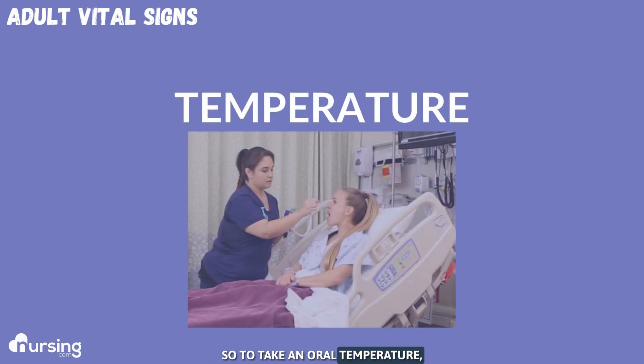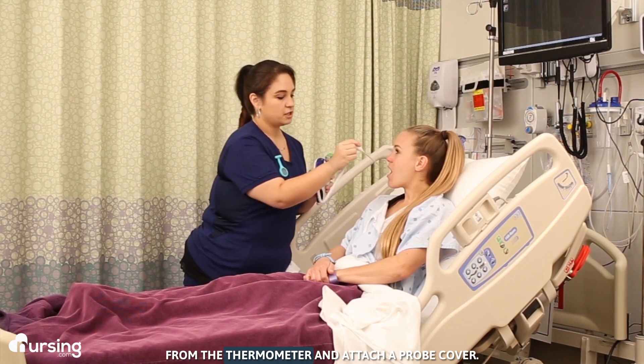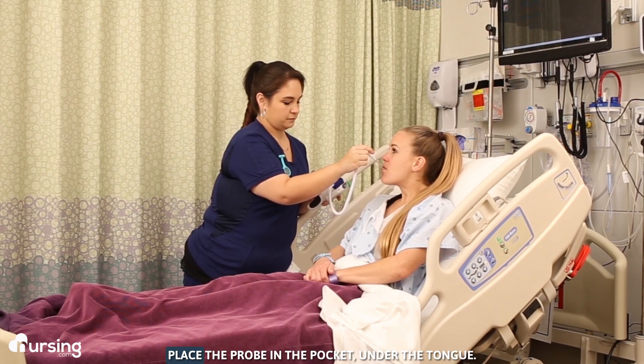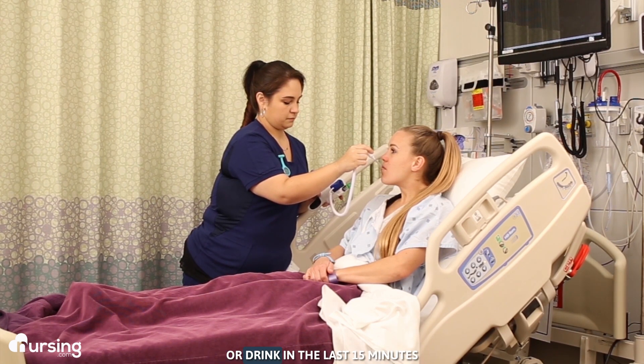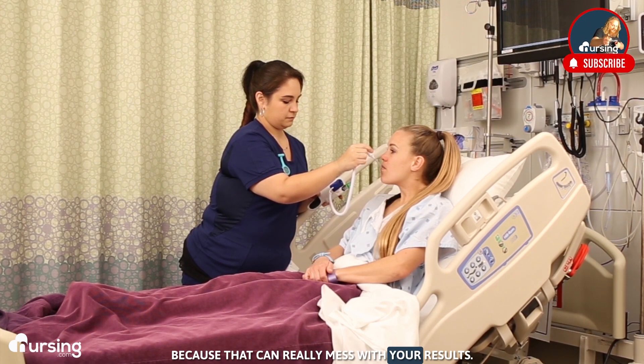To take an oral temperature, remove the probe from the thermometer and attach a probe cover. Place the probe in the pocket under the tongue and have the patient close their mouth. Make sure they haven't had anything to eat or drink in the last 15 minutes, because that can really mess with your results.